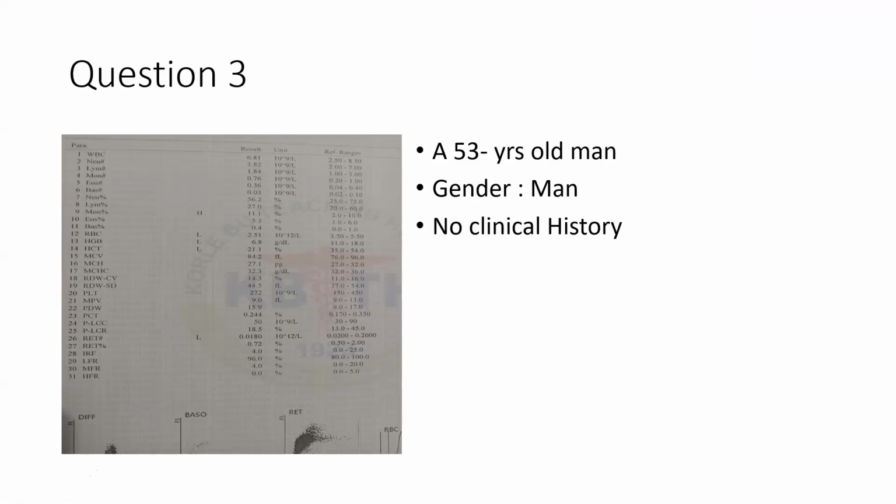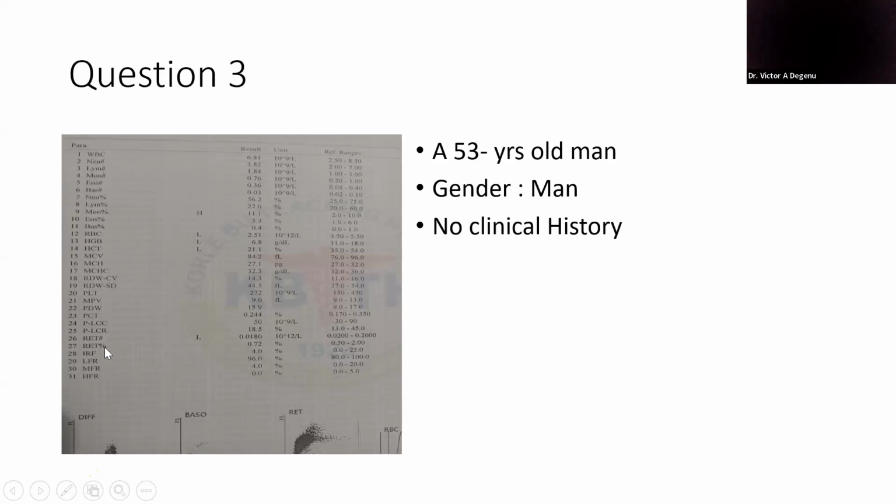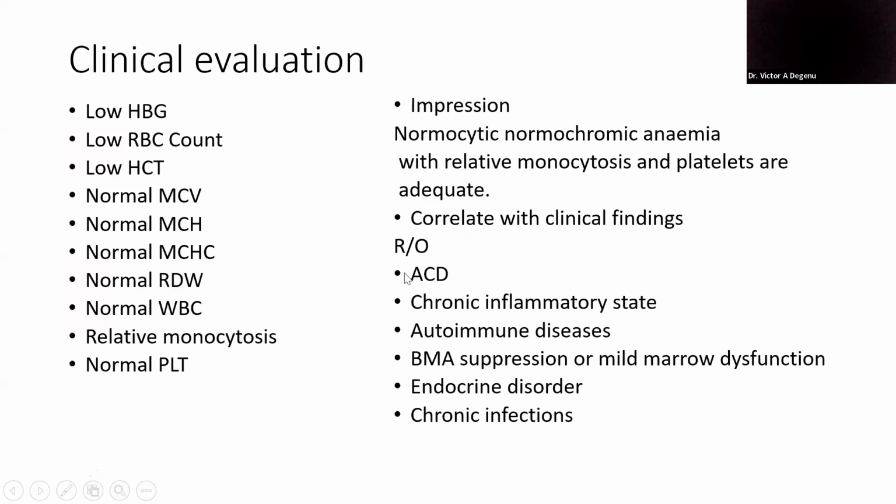If you look at the reticulocyte too, it seems that one is also low. So does it also point towards bone marrow malfunction? Exactly. It means the activity of red cell production is also impaired. Honestly, that one escaped me. I didn't look at that one.